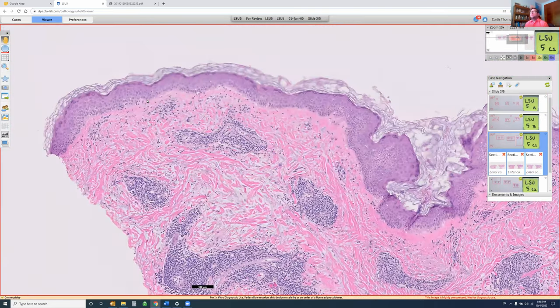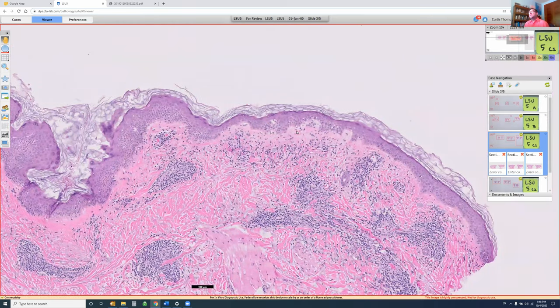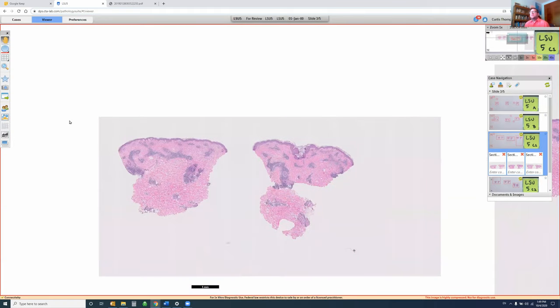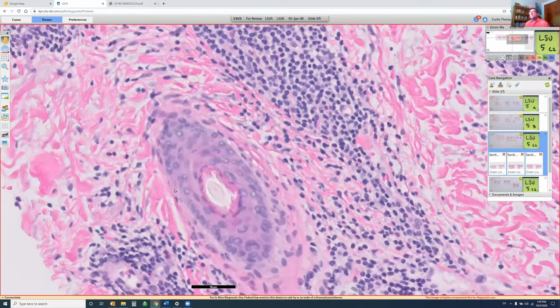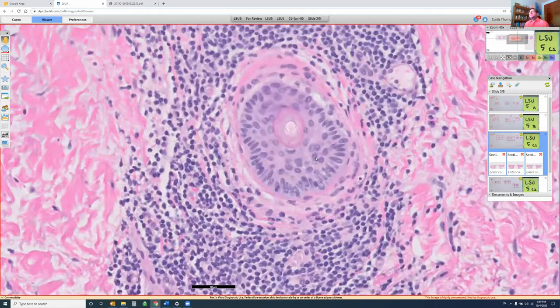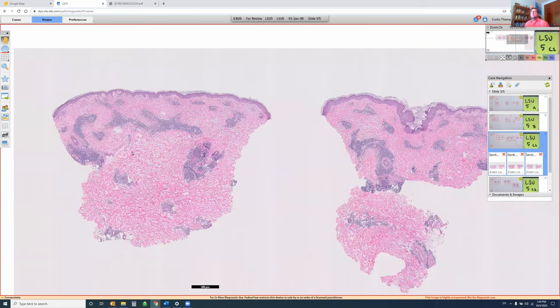I would have done a CD123 on this to be definitive, but I believe that's what it is. One other feature of lupus erythematosus tumidus or deep lupus: you may not see interface — perhaps in up to 50% of cases you won't see a good interface, so it's less important here. If you can find follicular epithelium, you might see some interface along there. We don't get really great perifollicular fibrosis in lupus like we see in lichen planopilaris on the scalp.